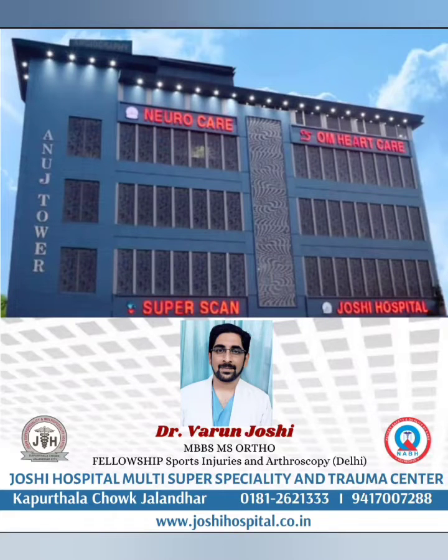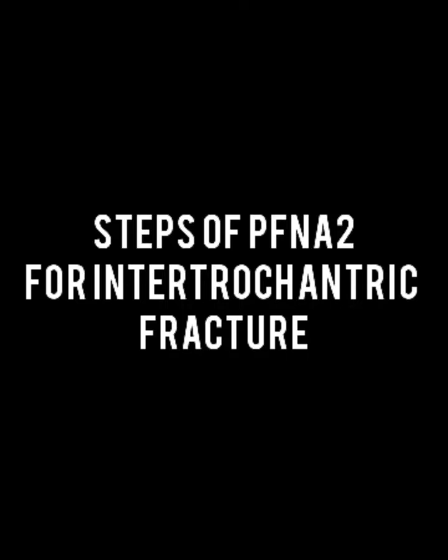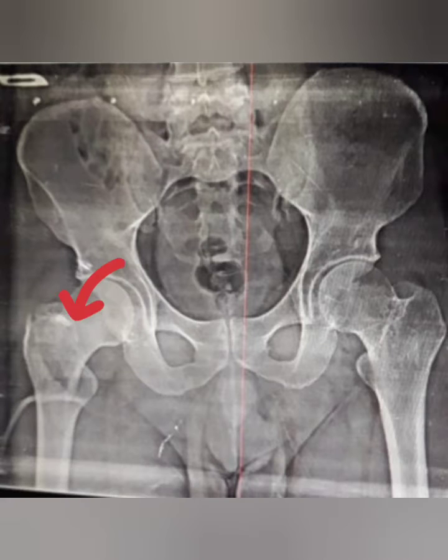Hello everyone, I am Dr. Varun Joshi, Orthopedic Surgeon at Joshi Hospital, and today I will be explaining about the steps of PFNA2 in intertrochanteric fracture. X-ray pelvis with both hips shows right side intertrochanteric fracture.